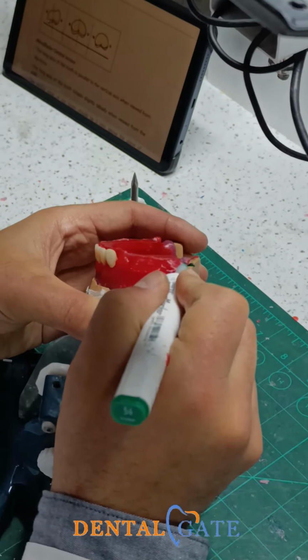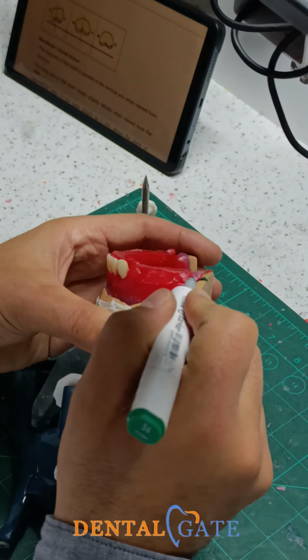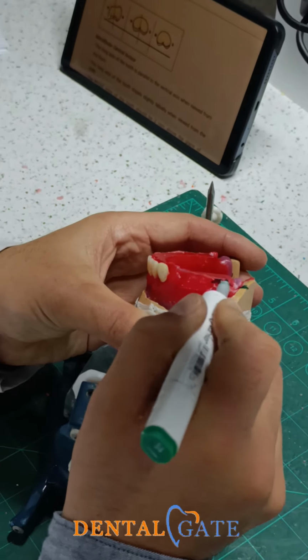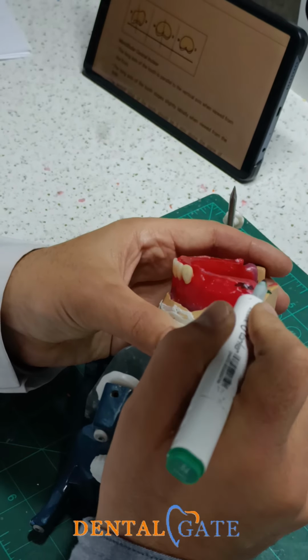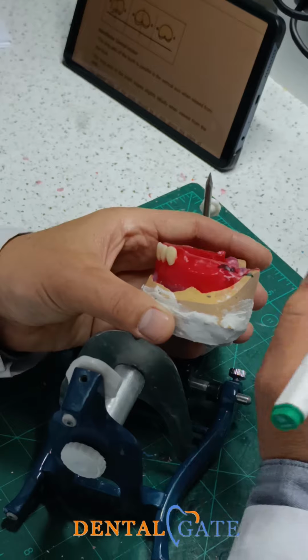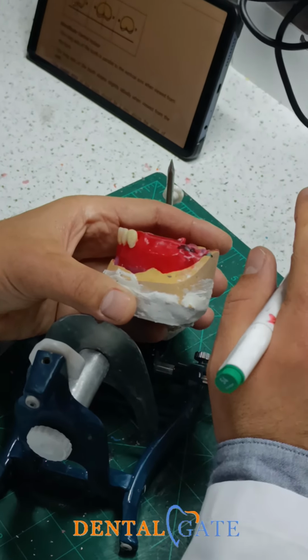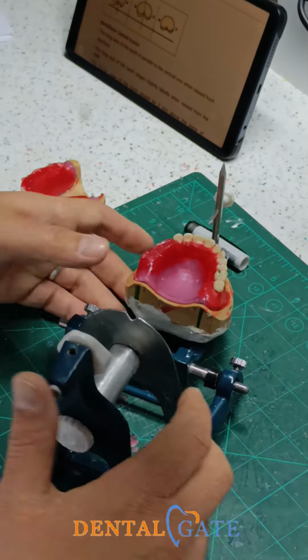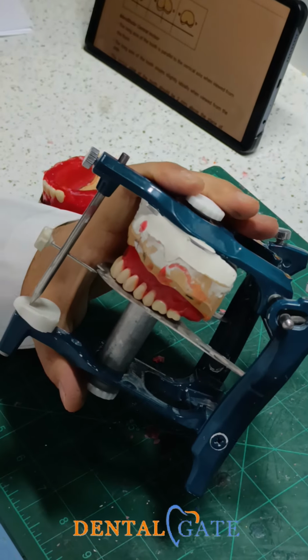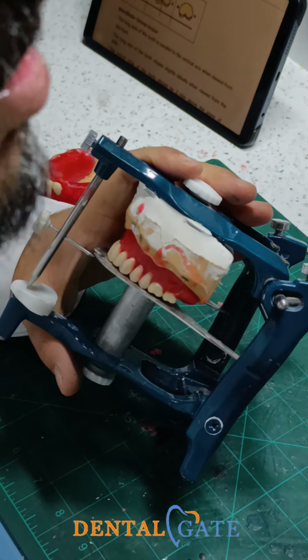I will check the lower 7. It should be located here. Okay. So I will check my upper tilting regarding the retromolar part. Okay. This is what I mean. Any question? So please, you can make adjustment. This is not final work.